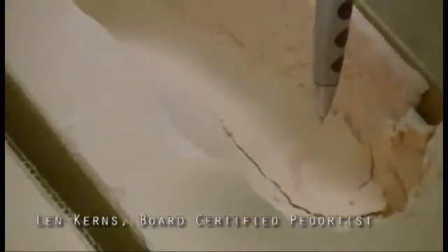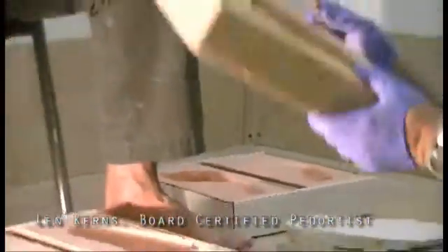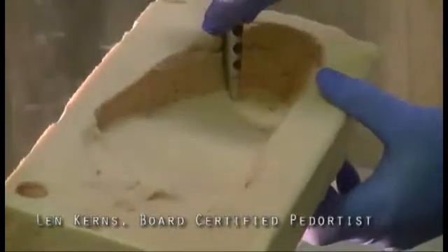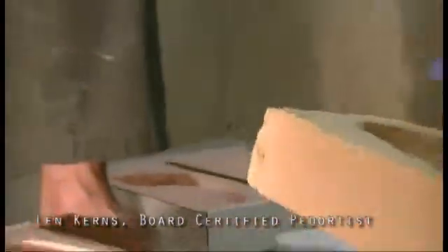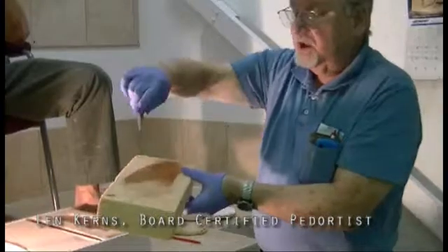If you're touching up here, that means you didn't push the whole forefoot down like I showed you previously in this movie. Again, I'm going to repeat it. Here's a right foot. Hold the pen all the way down, touch the top. You come over here and obviously you can see something's wrong. The fifth and the heel should go down the same level. And there's no excuse for it.